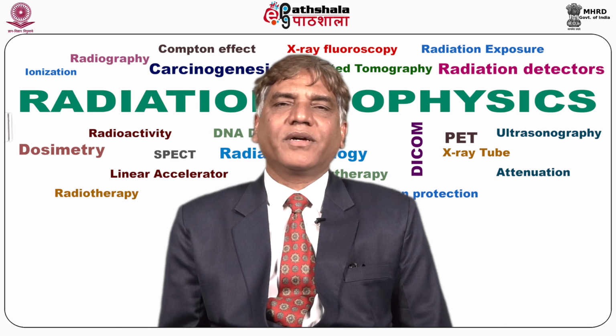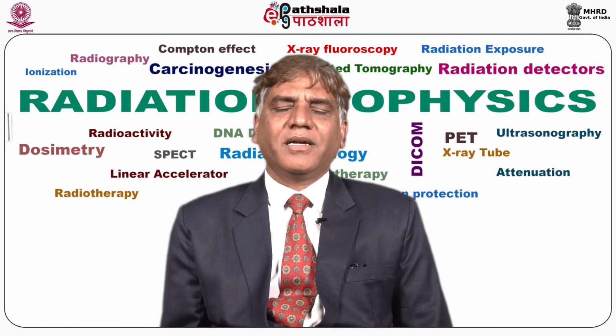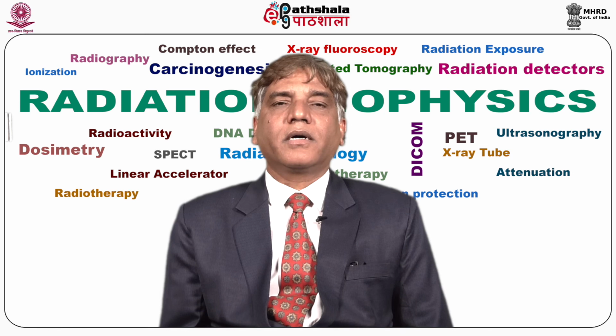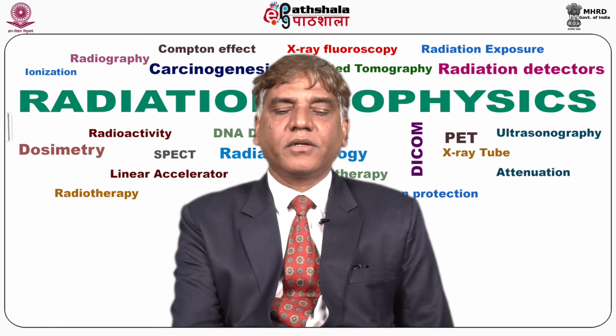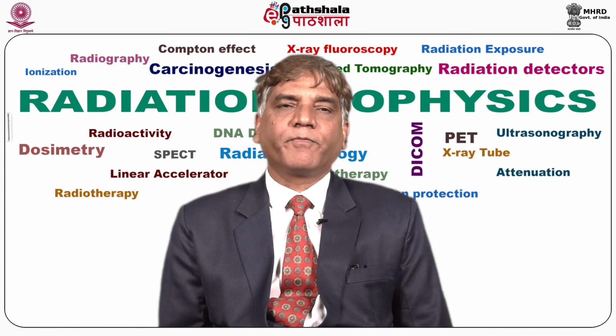Original scanners used 288 detectors. Newer versions of third generation CT scanner used up to 700 X-ray detectors. You can see here both the X-ray tube and detector assembly moved around the patient body, and it is a rotate type because both X-ray tube and detector are rotating.